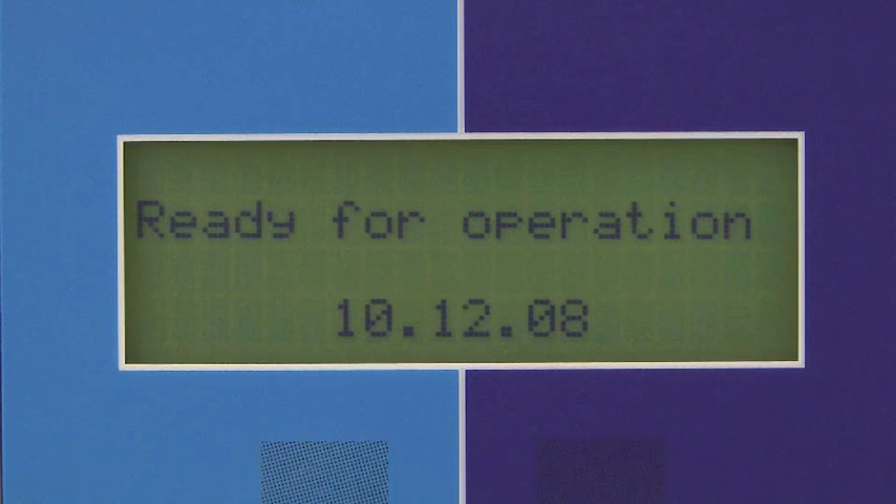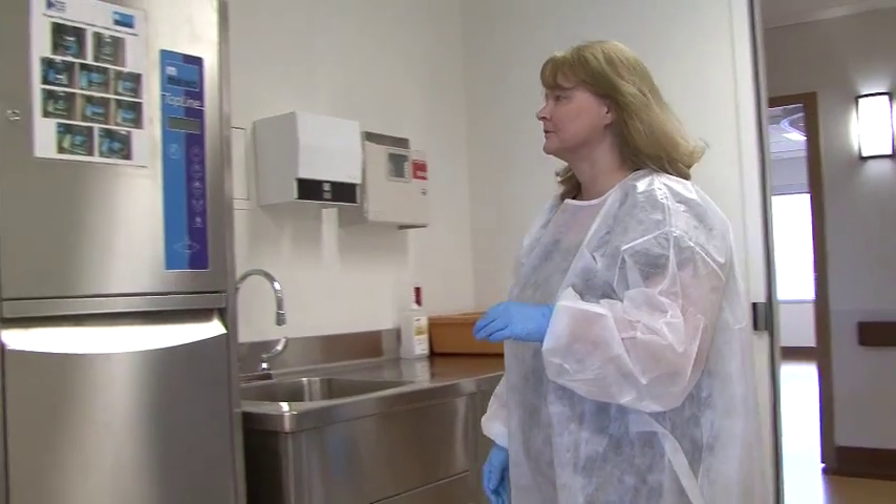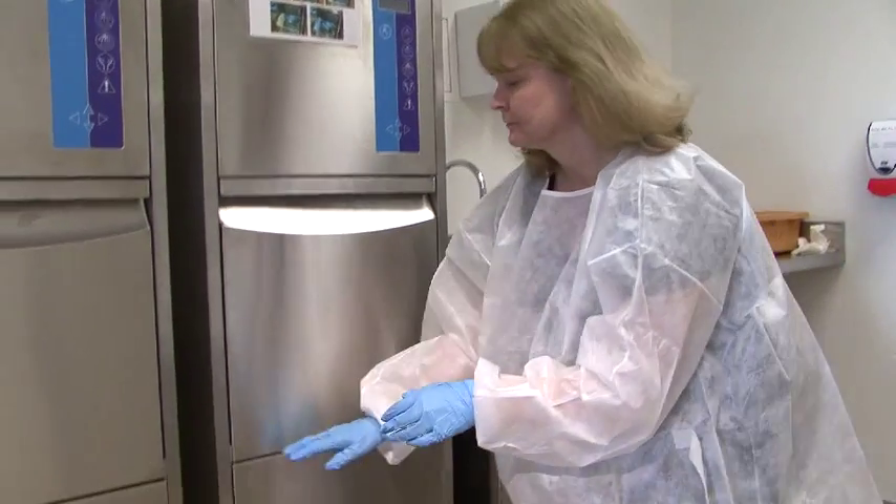Fail-safe mechanisms have been designed into the Myco to prevent unclean items from being used by patients. One of those fail-safes is the detergent softener dispensing mechanism.